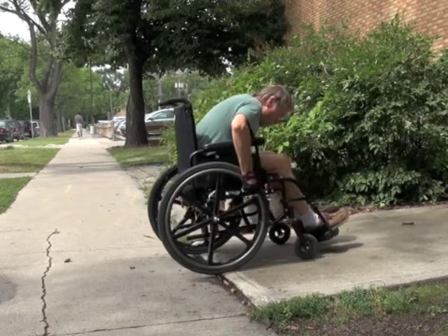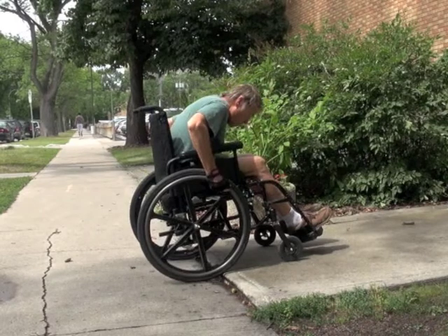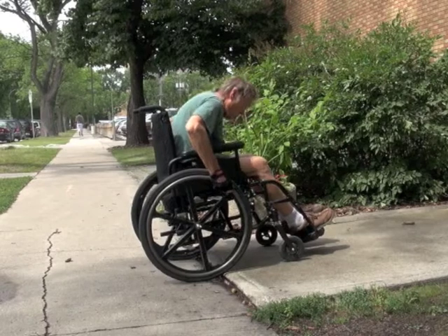Gently push the chair backwards until the drive wheels begin to roll off of the surface. Gripping the push rims firmly, slowly release your grip and allow the push rims to gradually slide through your hands as the drive wheels drop down onto the lower surface.